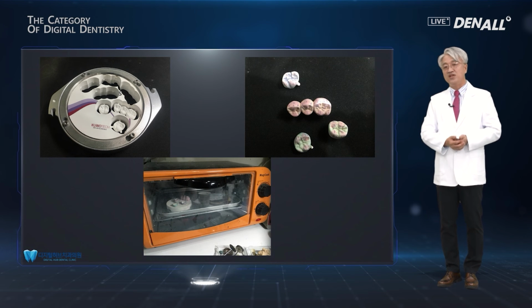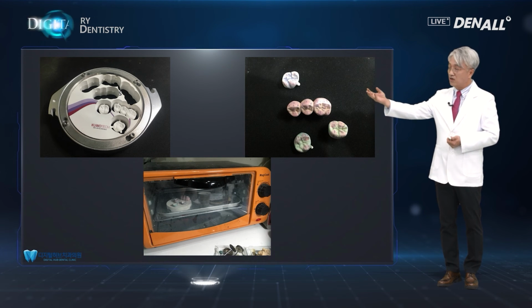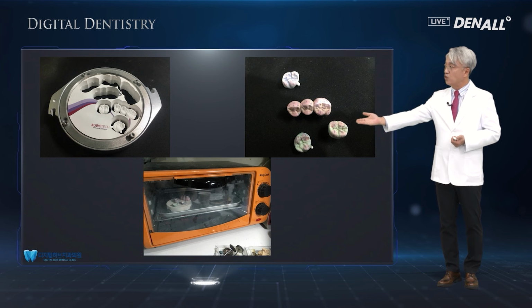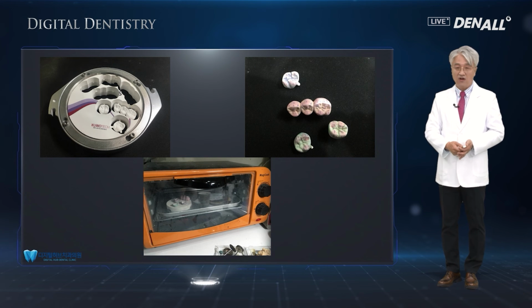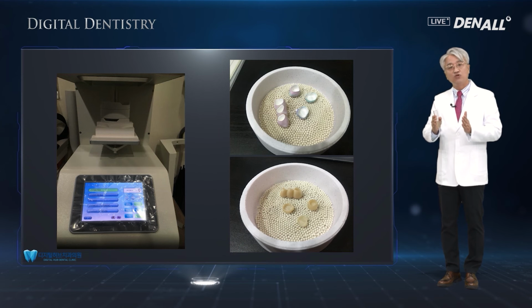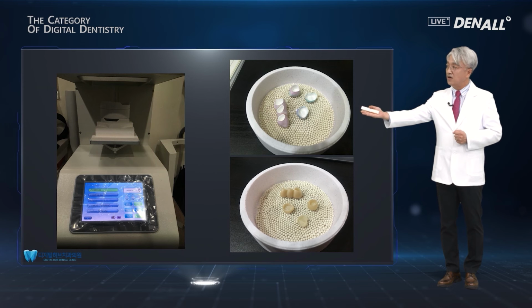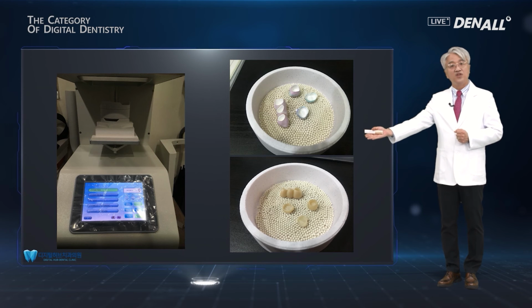In the milling machine, if the teeth are cut, this is how it becomes available, and the crowns are divided, and you can see here it's colored to look very close to your teeth, and then it's dried, and 7 to 8 or 10 to 12 hours, the colored zirconia blocks need to be baked at about 1500 degrees of temperature.